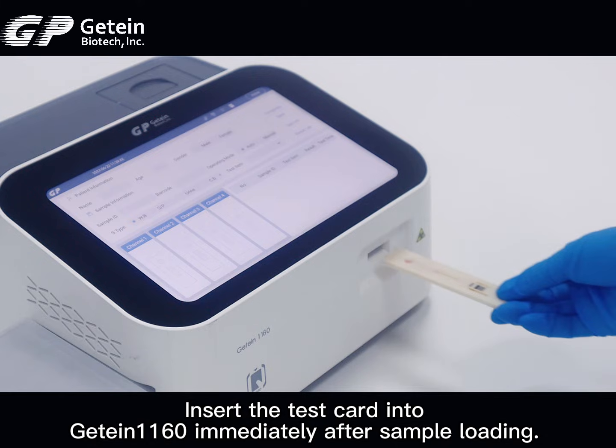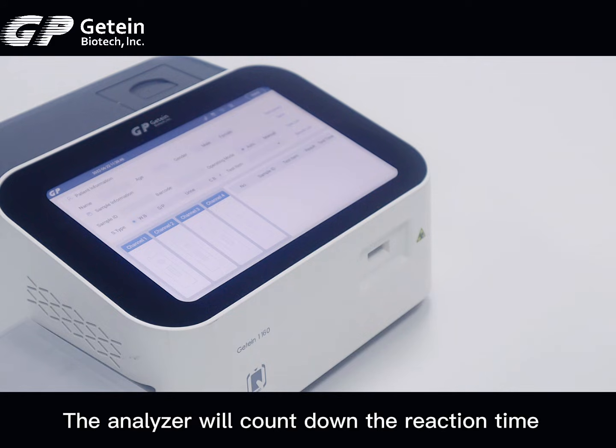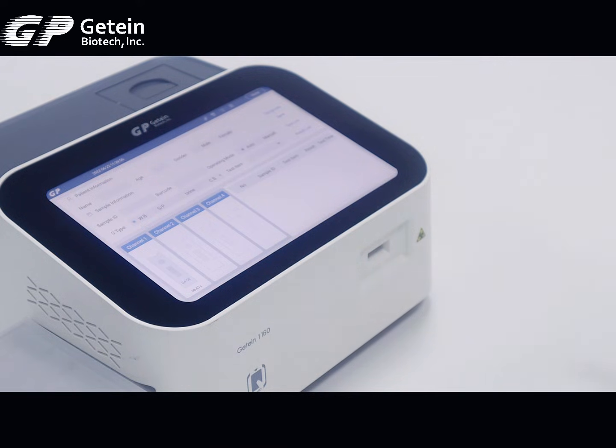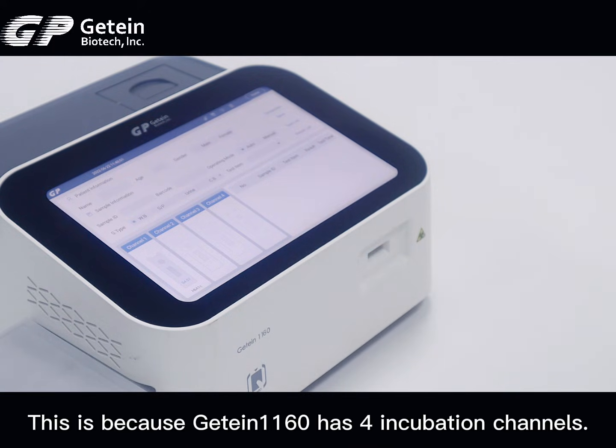Insert the test card into the GTIN1160 immediately after sample loading. The analyzer will count down the reaction time and automatically test the card after the reaction time has elapsed. When the card slot opens again, insert the next test card. This is because the GTIN1160 has 4 incubation channels.